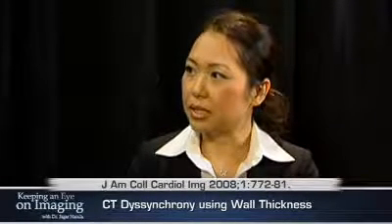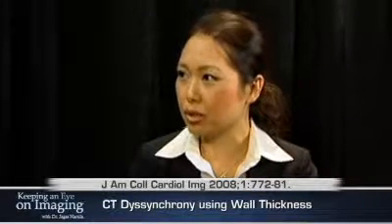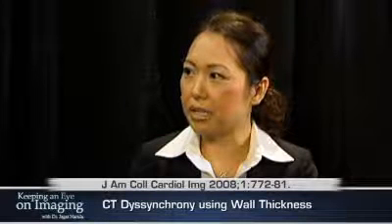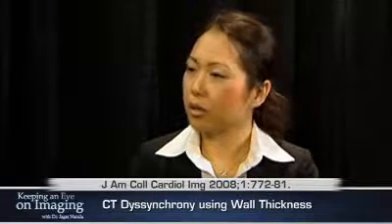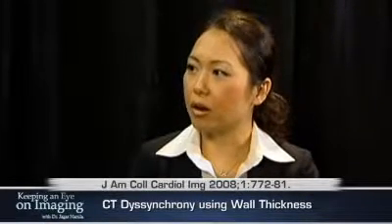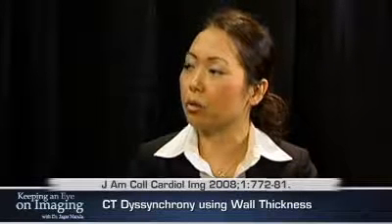There was significant difference in DI between the 3 groups, as well as between heart failure patients and normal controls. The highest DI was seen in patients who had the heart failure wide QRS, followed by the heart failure narrow QRS patients, with the lowest DI seen in patients who were in the normal control group.